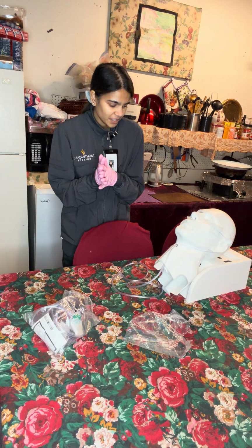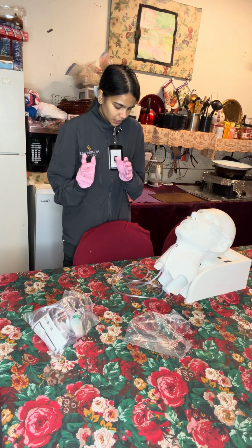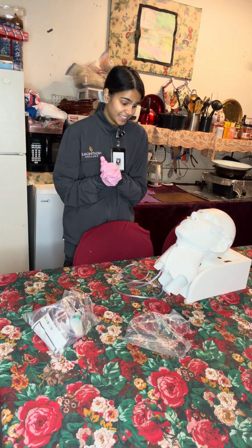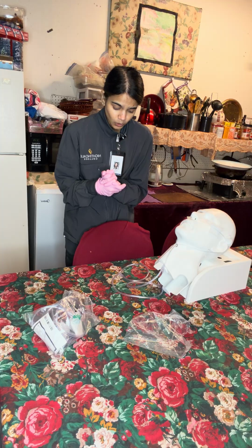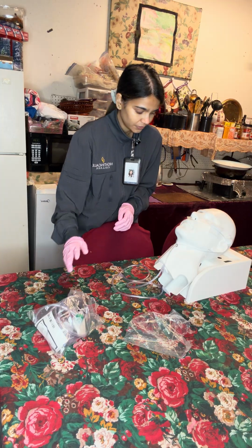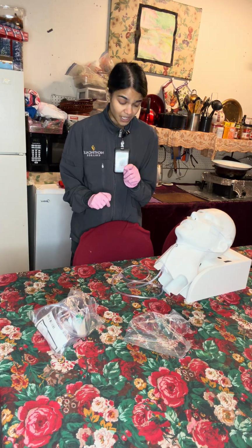Once the gauze has been secured, again, we'll check for skin integrity every 4 hours. The doctor has been noticing that the patient needs more oxygen, so we'll now be using the simple oxygen mask. For this, I will first need to remove the nasal cannula.